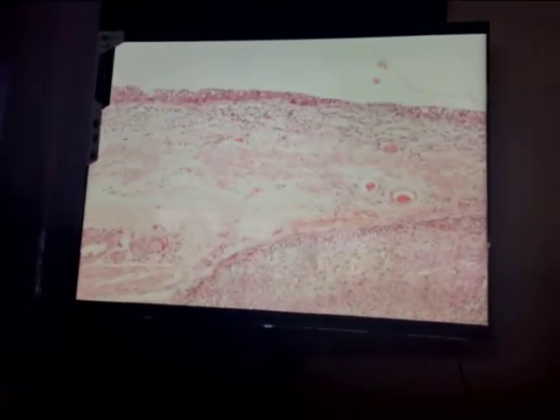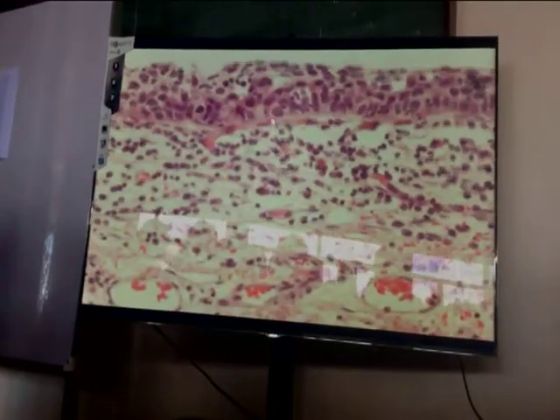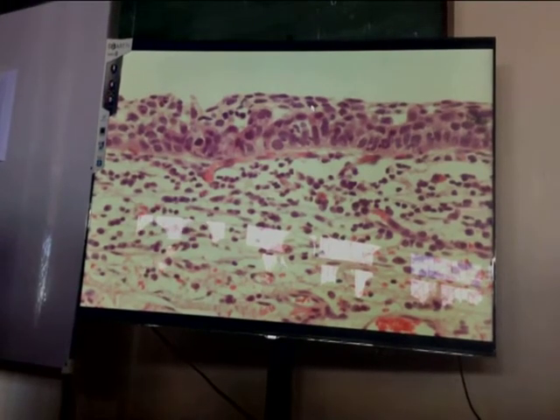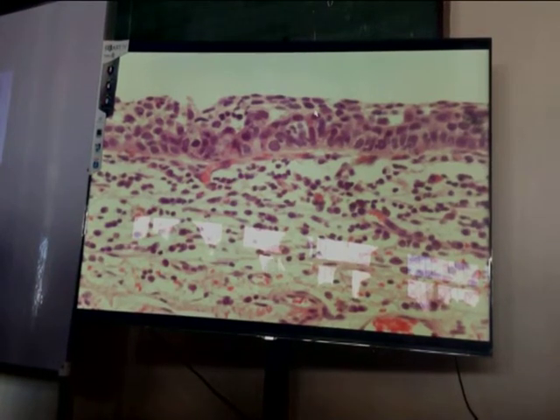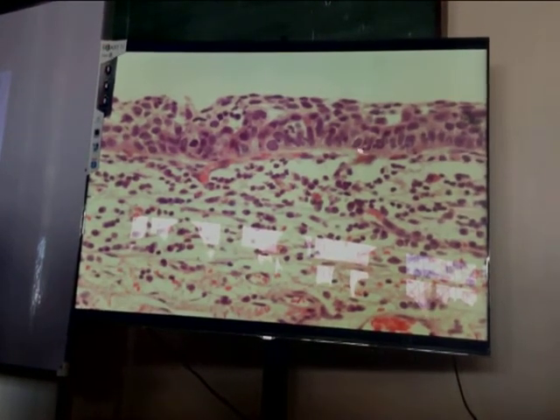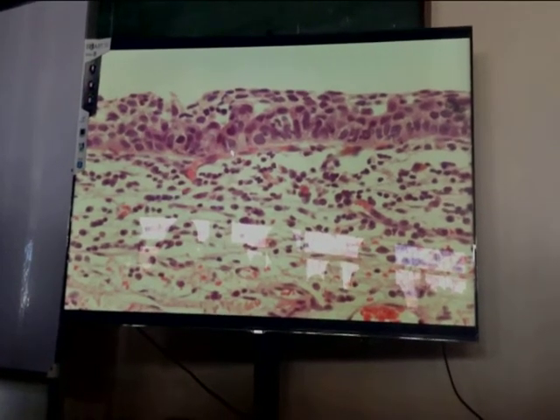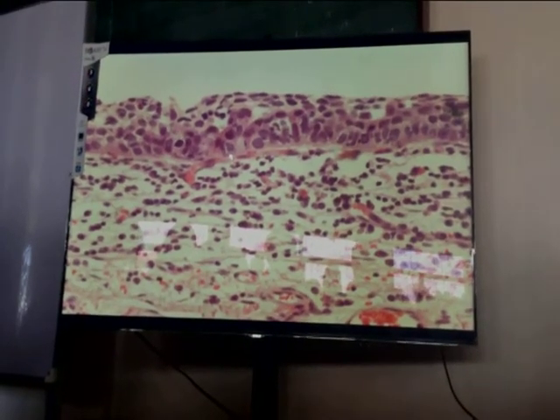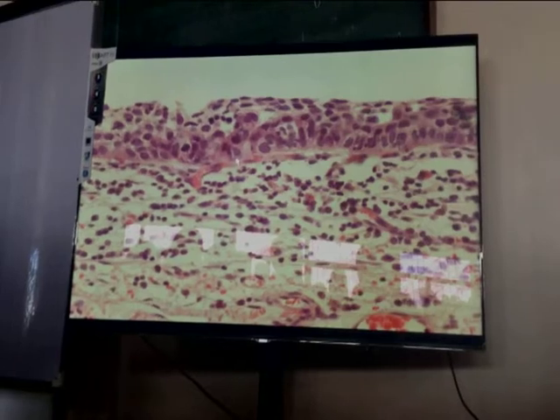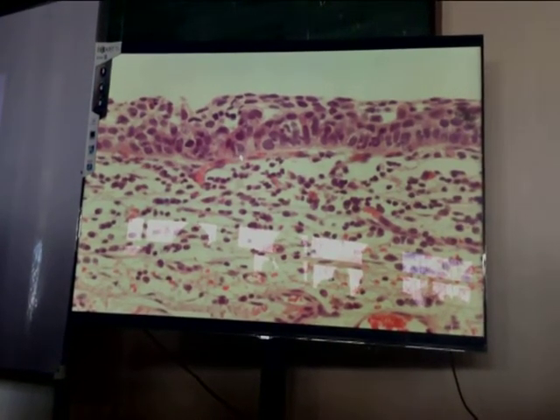So, eventually, from dysplasia, a malignancy which is limited to the epithelium has developed as evidenced in that portion. So, full thickness dysplasia. So this is already a malignancy limited to the epithelium because the basement membrane is still intact. What is the diagnosis for that condition if this is malignant already? Squamous cell carcinoma in situ.